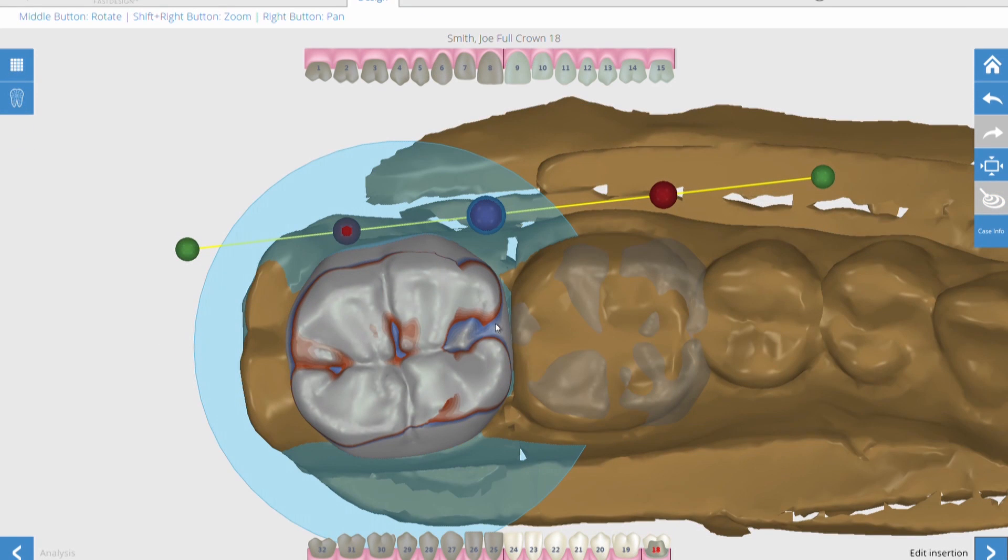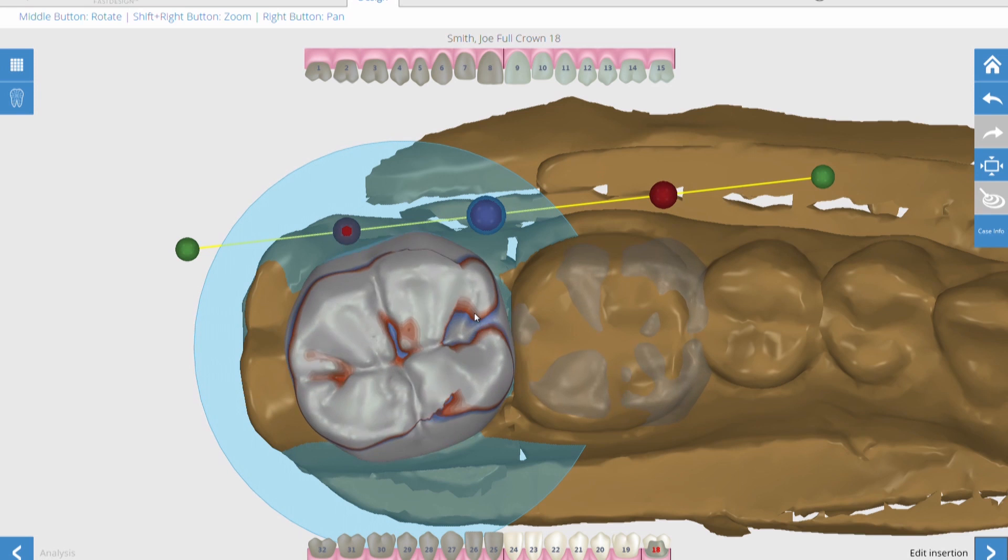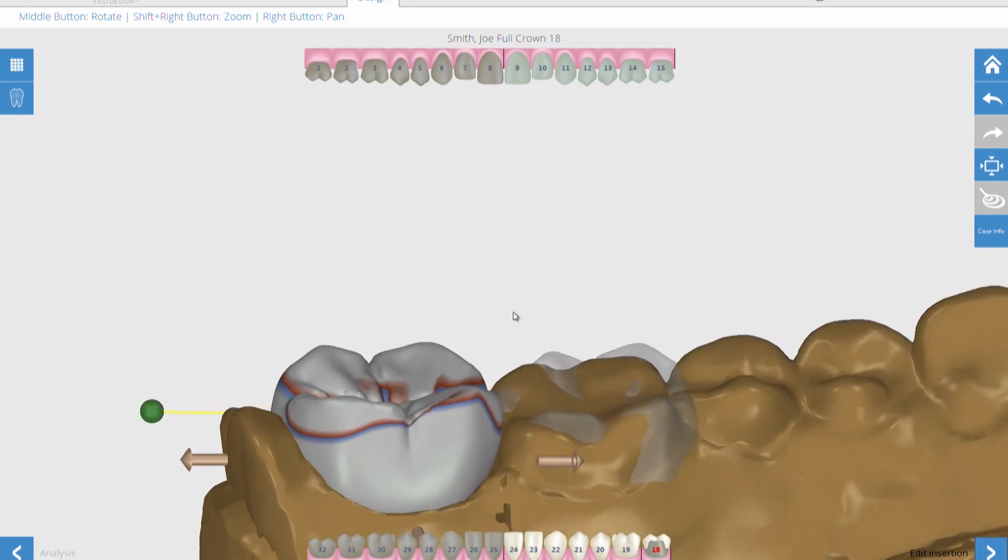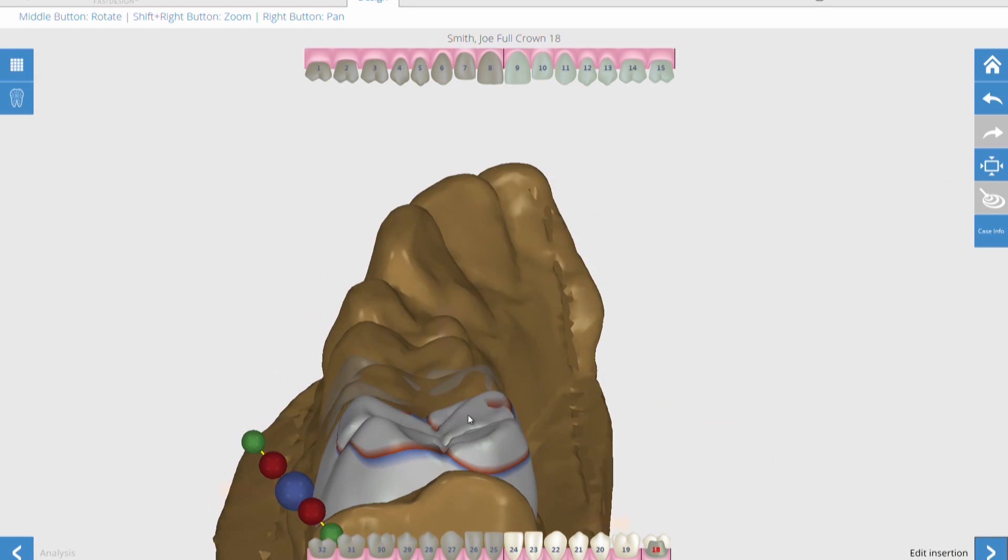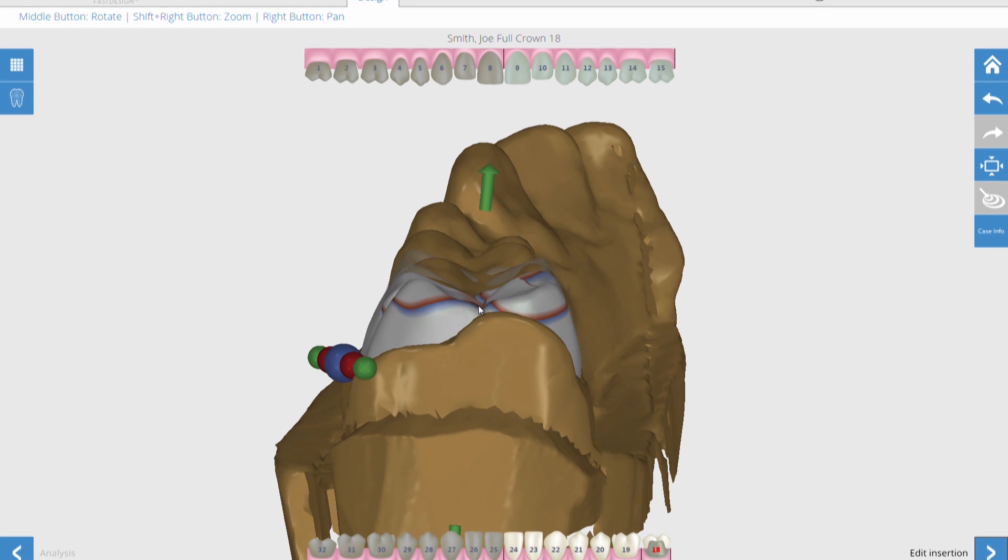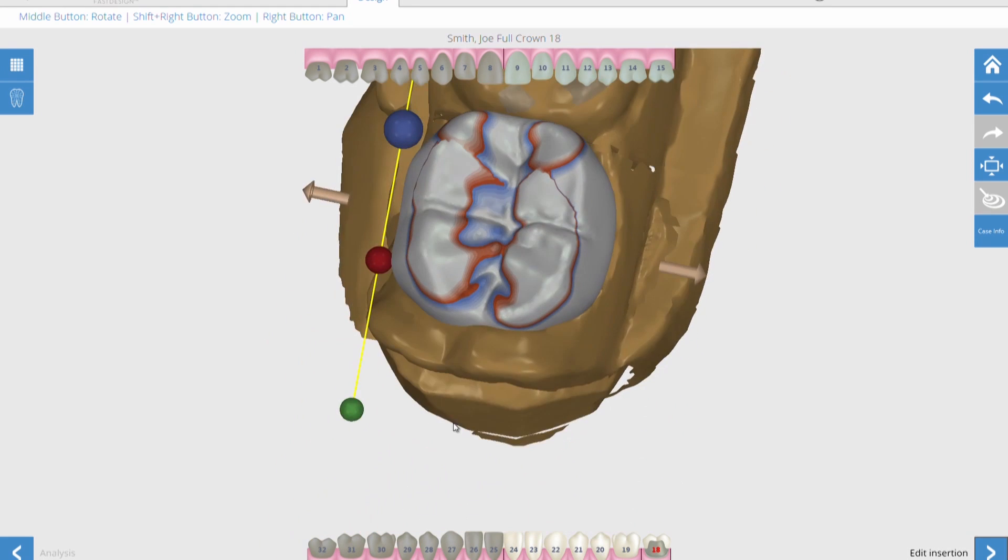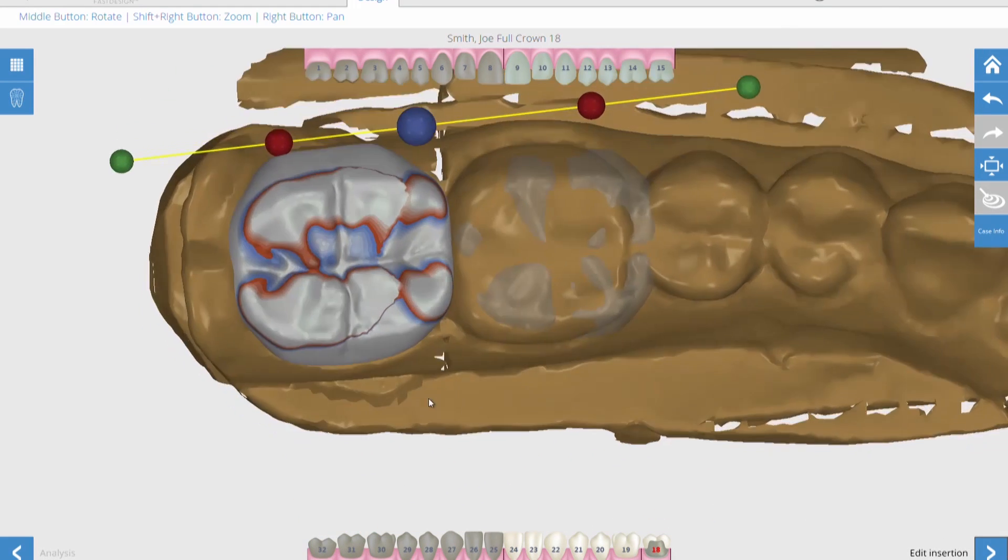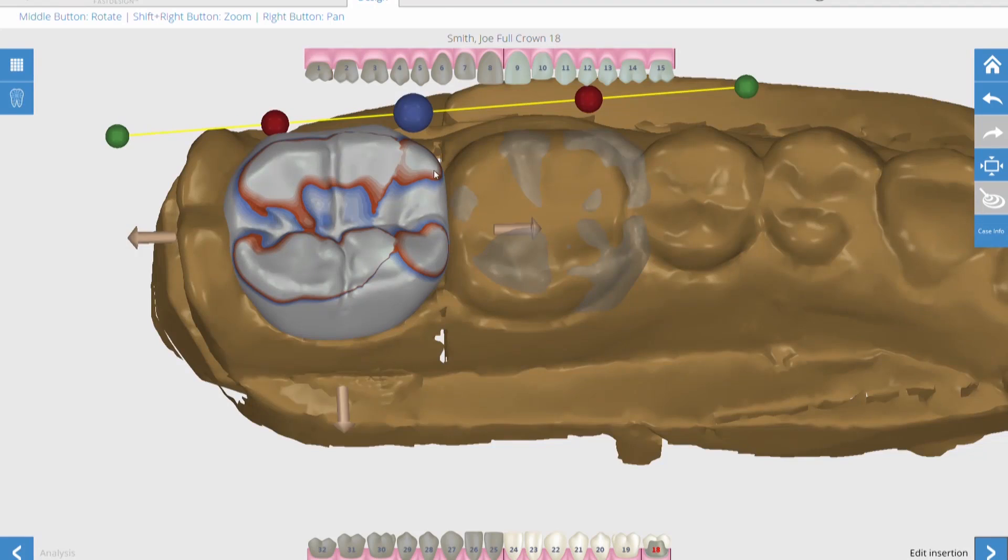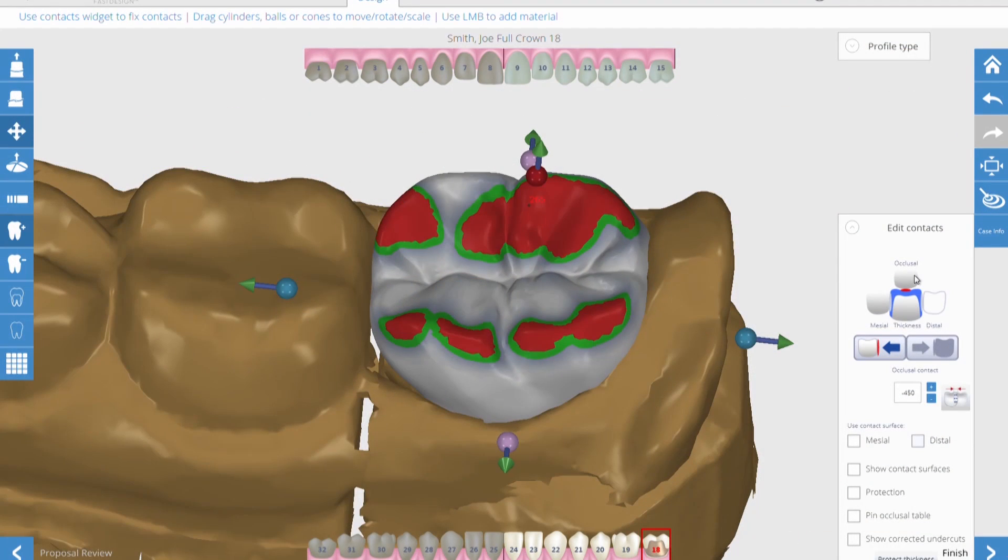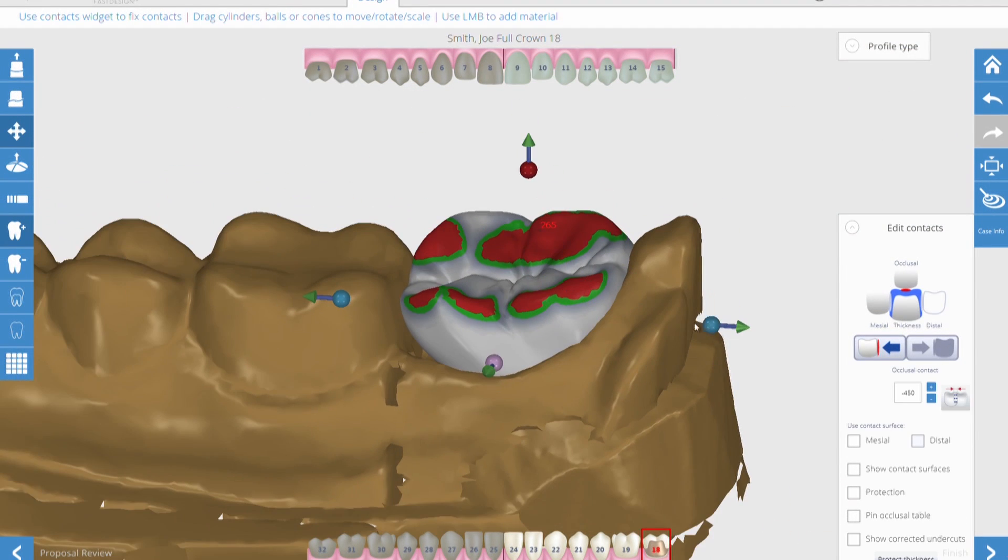Then it proposes a crown and rotates it into place. It takes from the anatomy library that we have in the cloud and brings down the most likely crown for that, puts it into place, and then matches up the marginal ridges and the width of the cusps with the adjacent tooth. And you can certainly play with that as much or as little as you want.